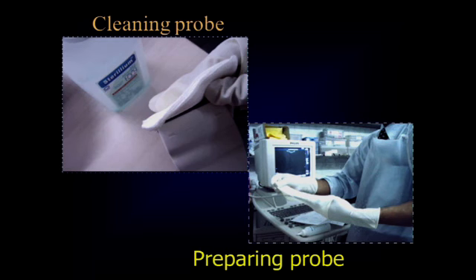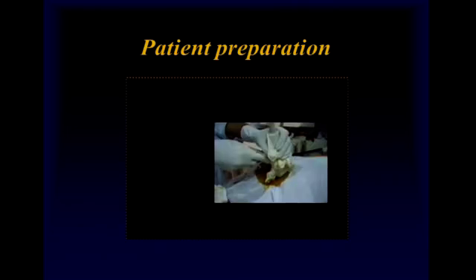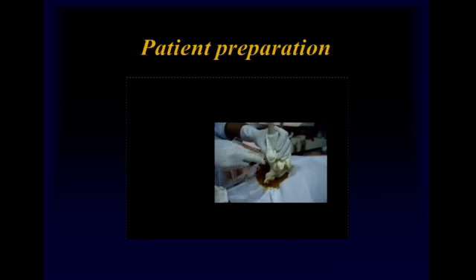It's very important to take complete aseptic precautions, and clean the probe properly as per the guidelines of your manufacturer. All the accessories like the guides, guns, etc. have also to be properly sterilized as per the requirements of the manufacturer. Even when we prepare the patient, it is better to clean the patient properly with iodine or betadine, and also drape the part so that we do not touch any area which is unsterile.